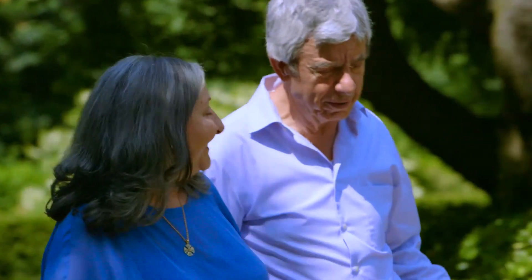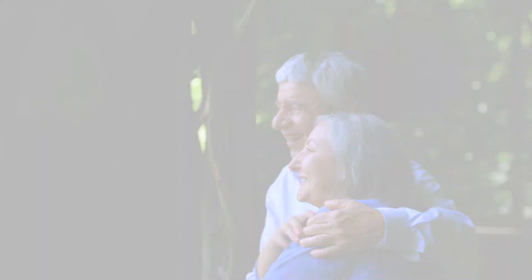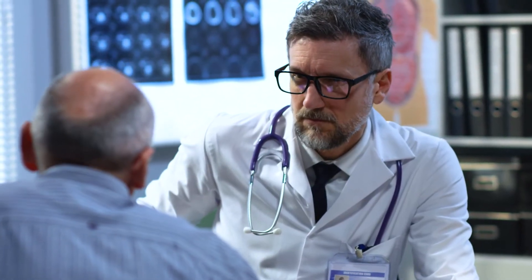You will need to consider lifestyle changes with managing equipment and living with the HeartMate LVAD. If you choose LVAD therapy, your specialized LVAD care team will be with you every step of the way — before, during, and after the surgery.